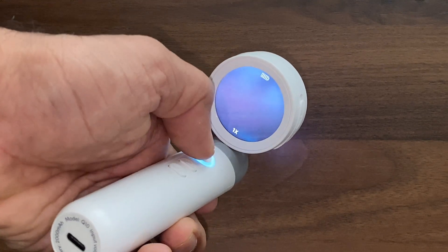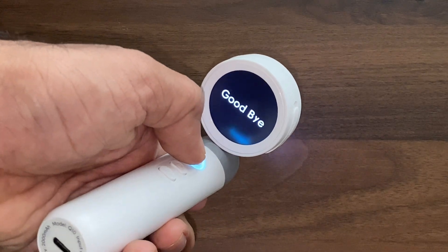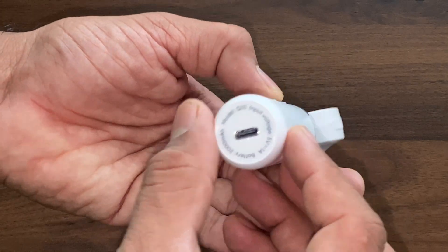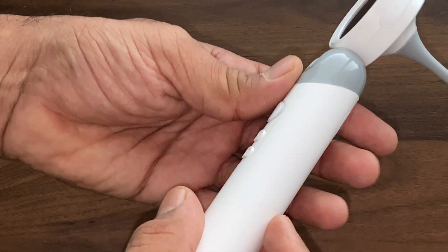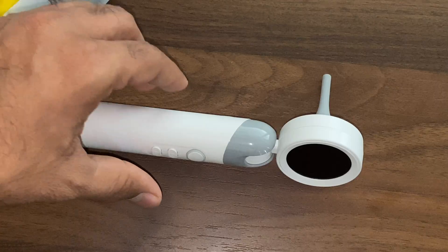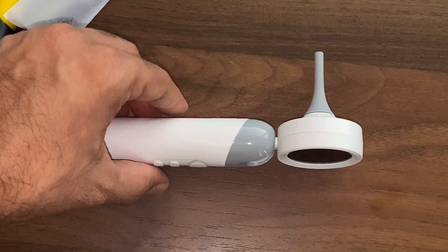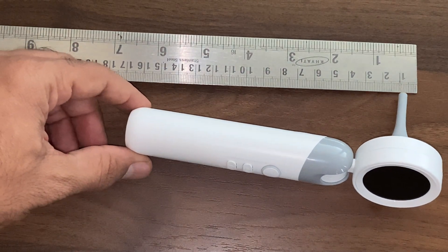Whenever you want to switch it on, press and hold for 3 seconds. To turn it off, press and hold for 3 seconds. If you want to take a video, press and hold the photo button for a few seconds and it will automatically switch from photo mode to video mode. Photos are taken in JPG format whereas videos are taken in AVI format.